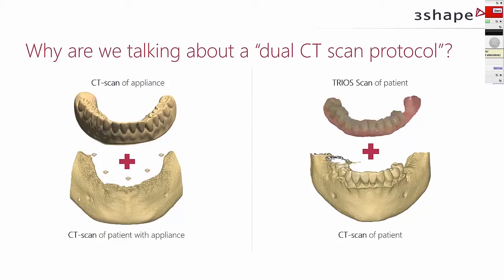Good. So now we understand the main differentiator to the normal protocol using an intraoral scan or an impression from a patient. So let's discuss the pros and cons of the dual scan protocol, and why people are still using it.